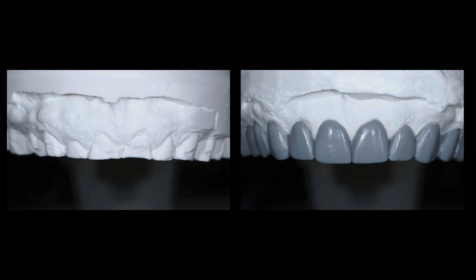It's a patient that came in with a lot of erosion, attrition, and tooth wear. So the teeth are already somewhat prepared. Because of the amount of erosion and attrition on the teeth, there's no need for me to excessively prepare these teeth. There's no reason to. We need to additively build the tooth structure. You can see the before model next to the diagnostic wax-up, and you can appreciate the amount of volume of tooth structure we're adding with this wax-up.